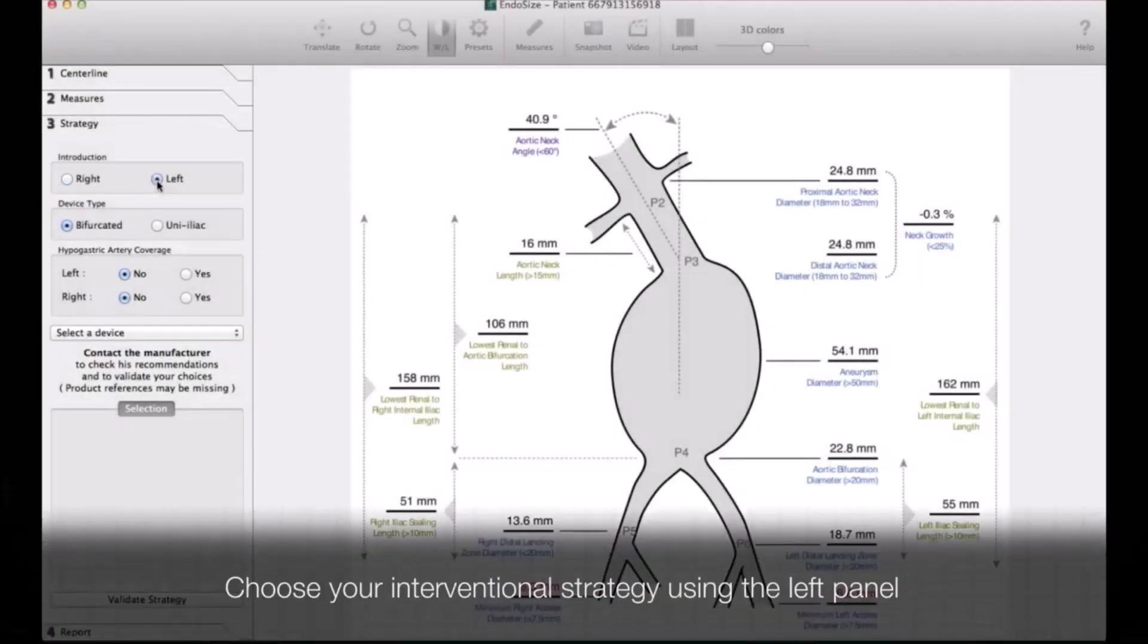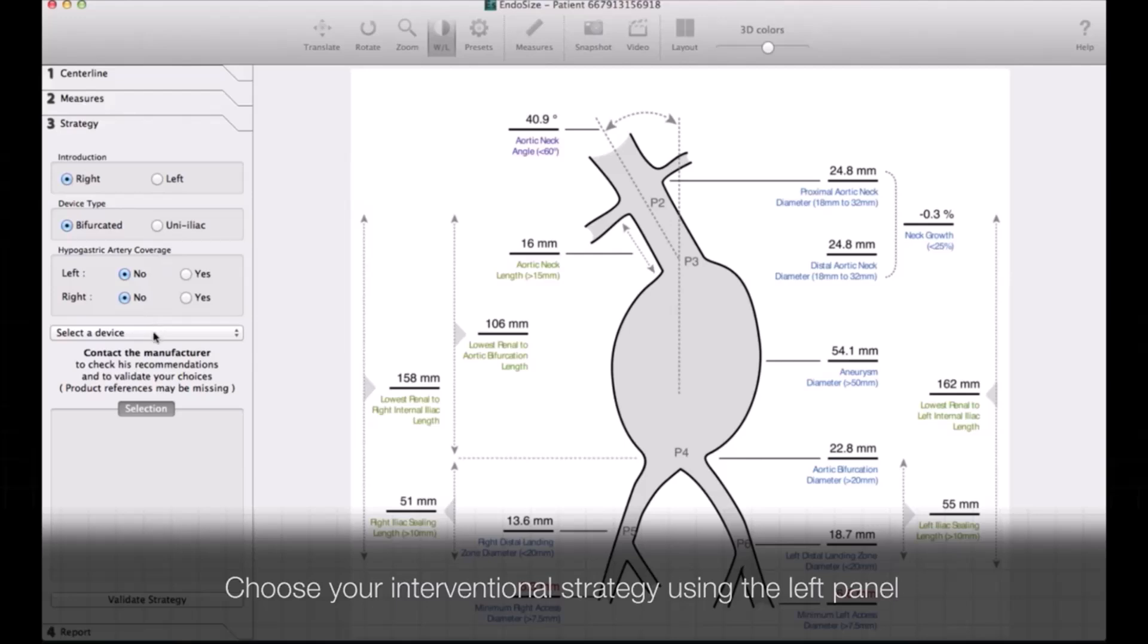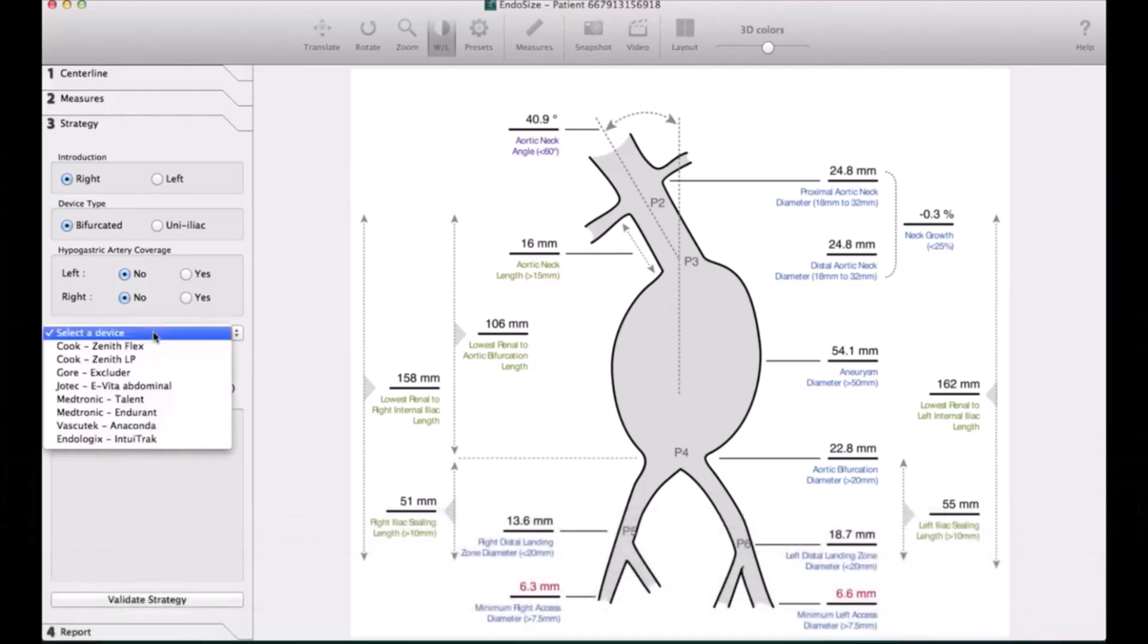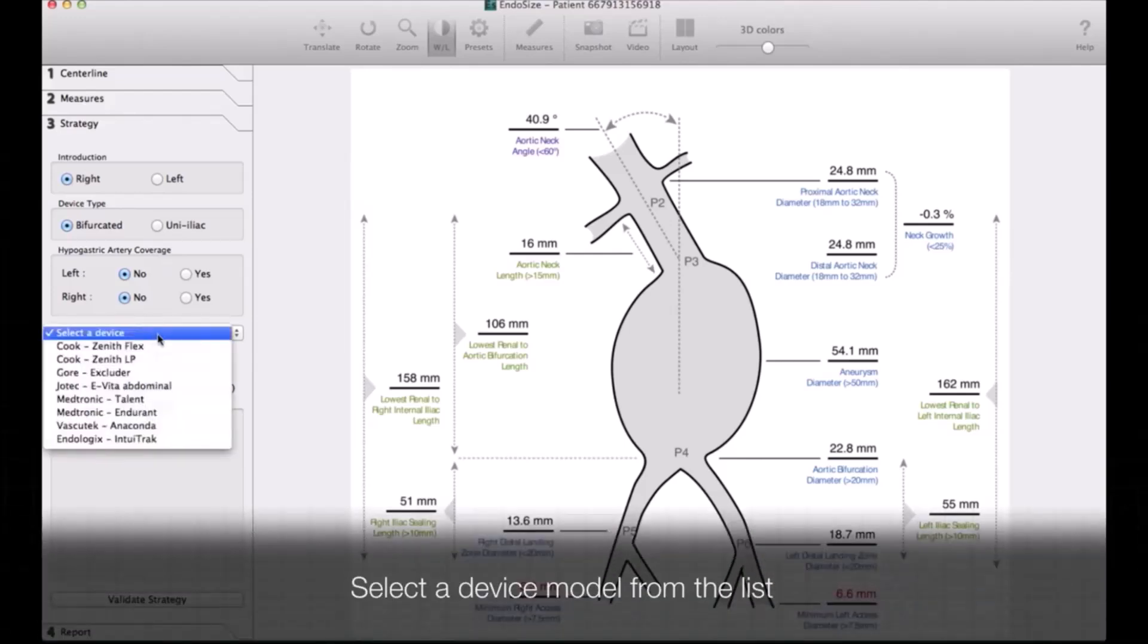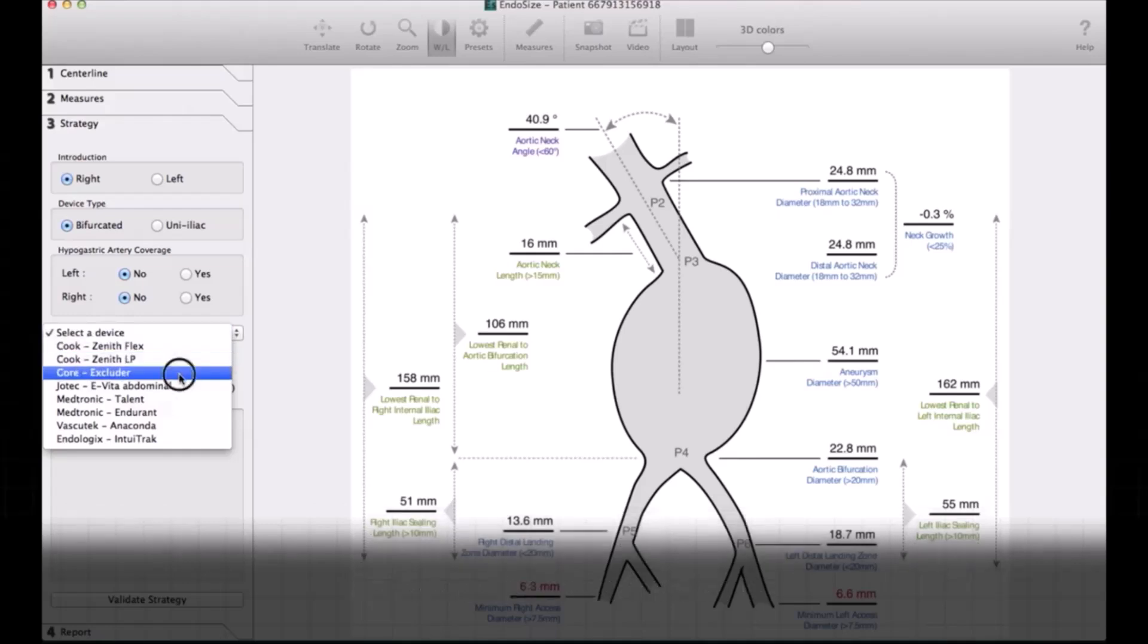Then you go to device selection. This selection is updated every month with new companies.